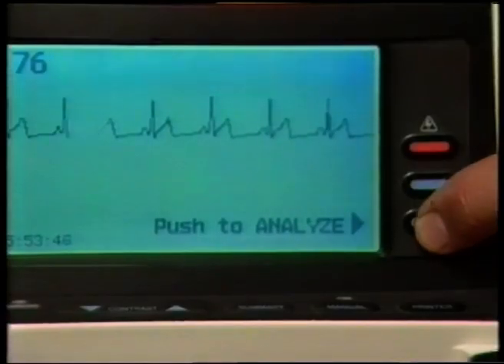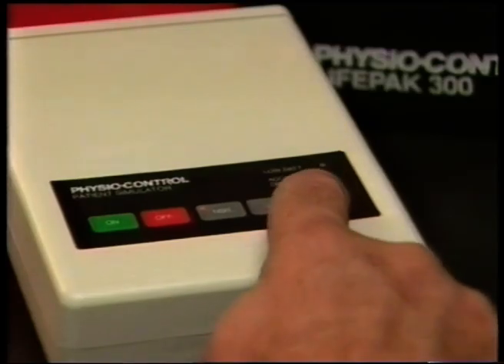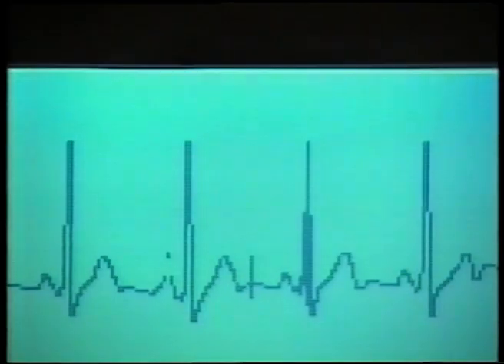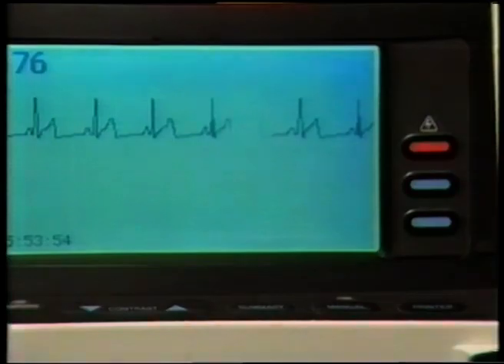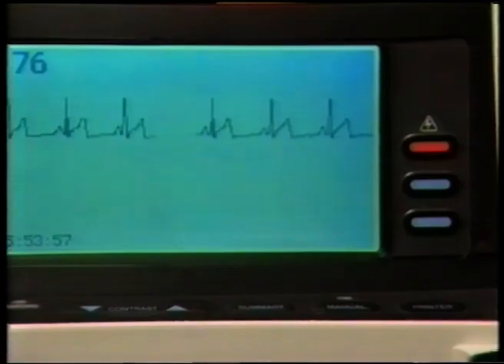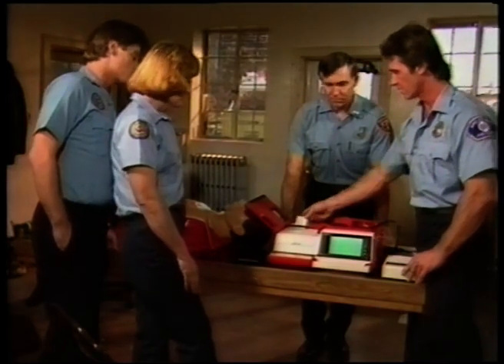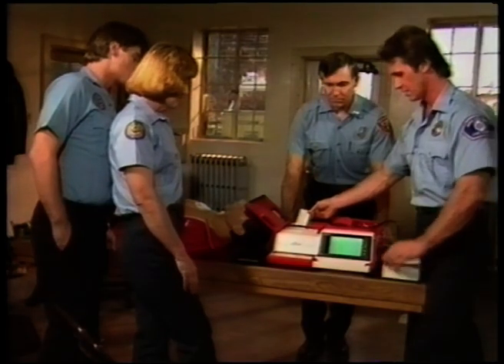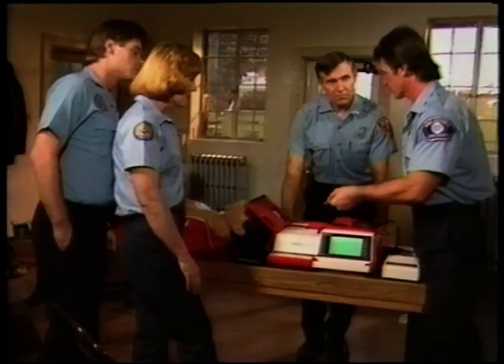Push the Push to Analyze display button and immediately push the Motion Control button located on the patient simulator. Verify the motion detected display message. Allow analysis to resume and verify the No Shock Advised display message. Push the Printer button and verify that the time, date, and heart rate information is correct. Check to see that there is enough paper in the recorder.